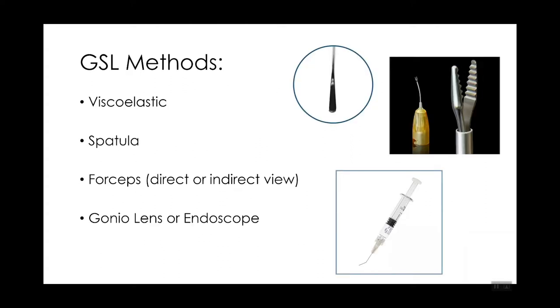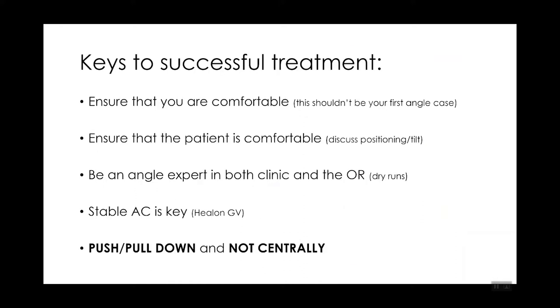There are various methods that can be used for GSL. Viscoelastic on a cannula can be used to separate the PAS with a mechanical force. A spatula like a Koch spatula, and forceps under both direct and indirect view are options. A gonio lens is key, but you can also use endoscopy. I'll go over a couple of cases to illustrate the different techniques.